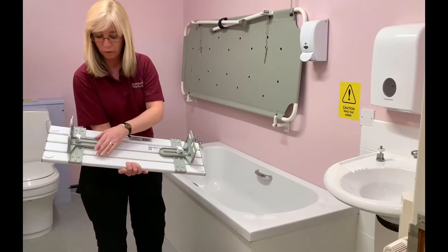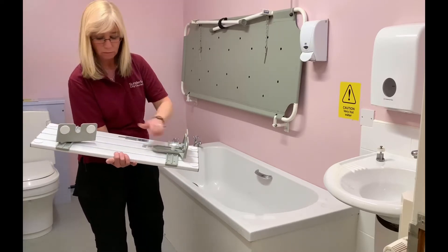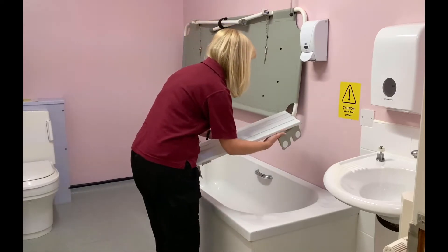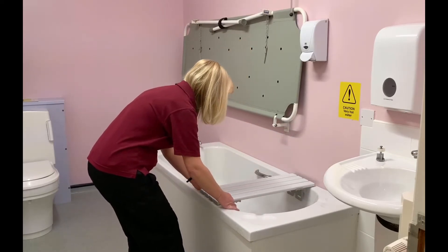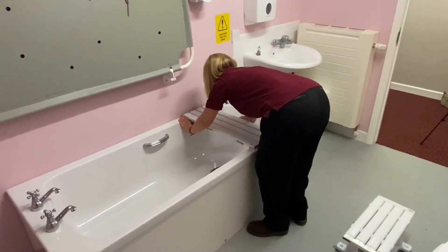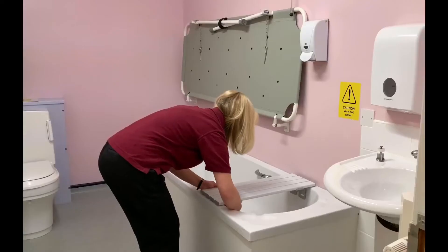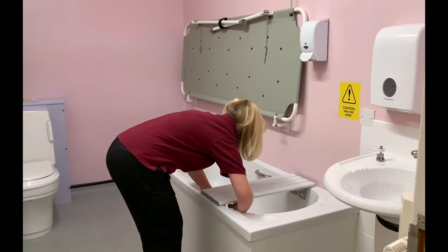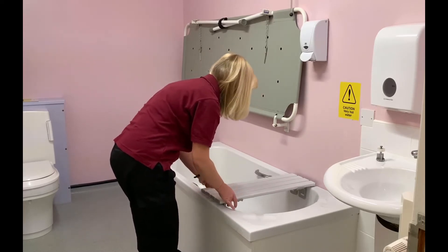The bath board is adjusted by changing the screws upwards and downwards. To ensure it is fitted securely, we place the bath board over the bath ensuring that both edges are dry, with over an inch at either side to secure it. The underside is then adjusted to ensure there is only slight movement.